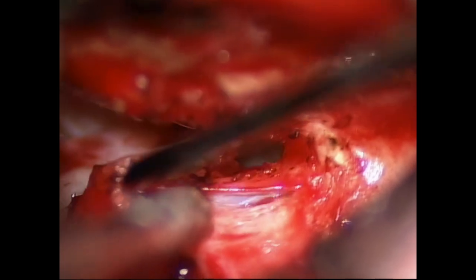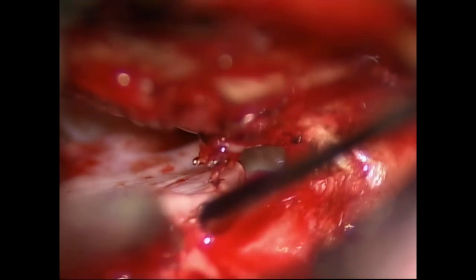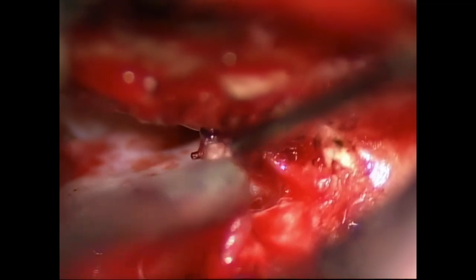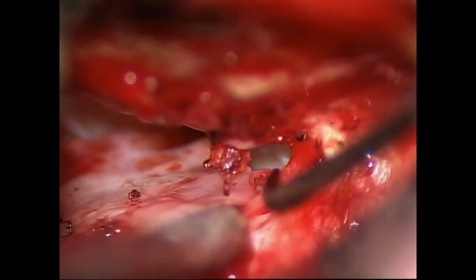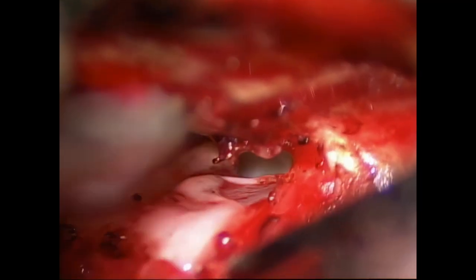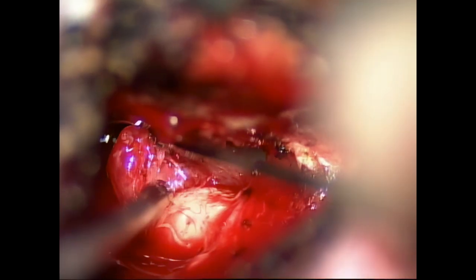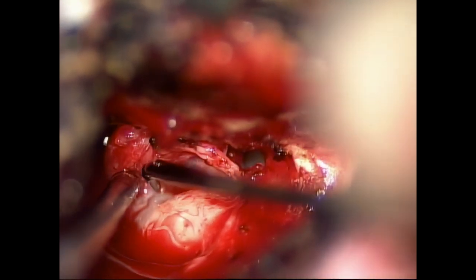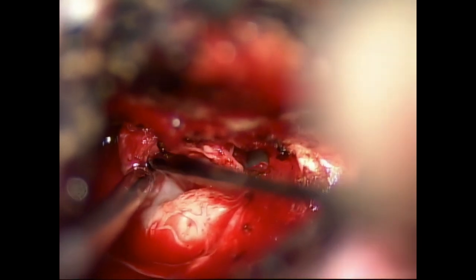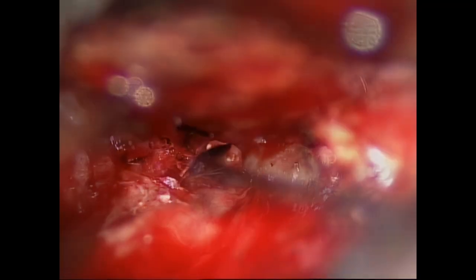Despite that, you do see that in the lower part of the middle ear there is a lack of a capsule. So the capsule is still limited over much of the region where the promontory or oval window region where the mucosa was abnormal or removed from the extirpation of the original disease.